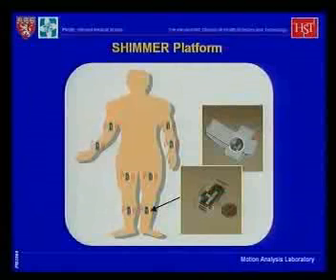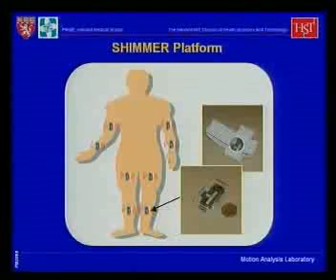So we started the project by utilizing ambulatory technology, and then in order to be able to move to field type of assessments, we rely on wireless units. These are called SHIMMERs, that were developed by Ben Curris, who was part of the R&D Intel group in Cambridge, Massachusetts, that we collaborate with. And in fact, this was a development that occurred in collaboration with us. So these are wireless units that allow you to implement the body sensor network.